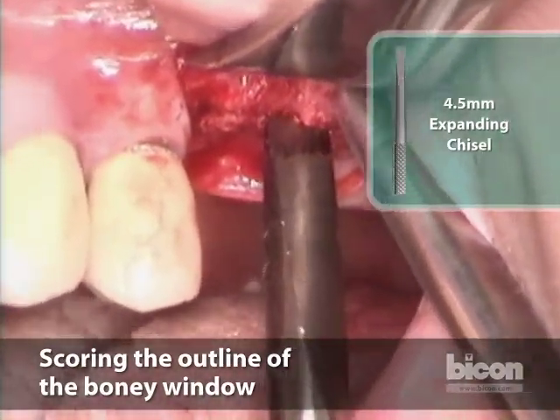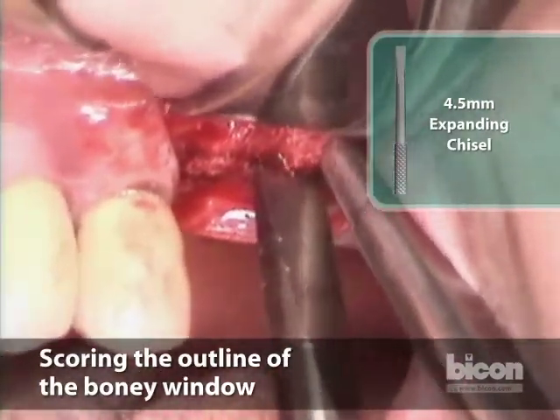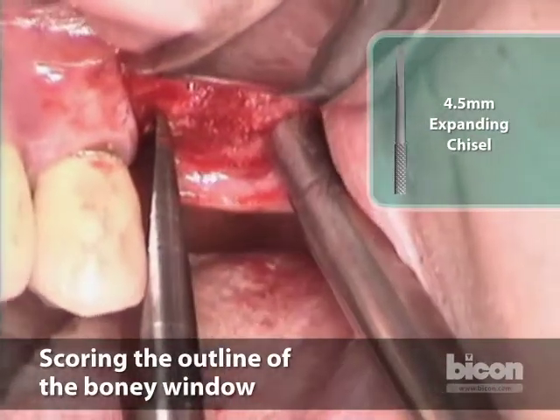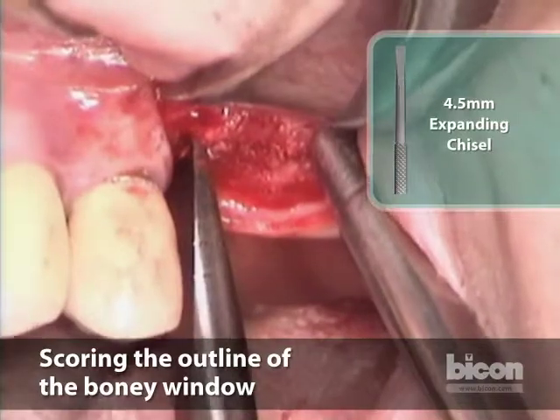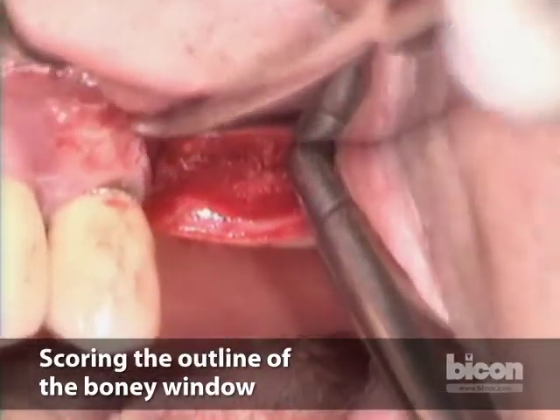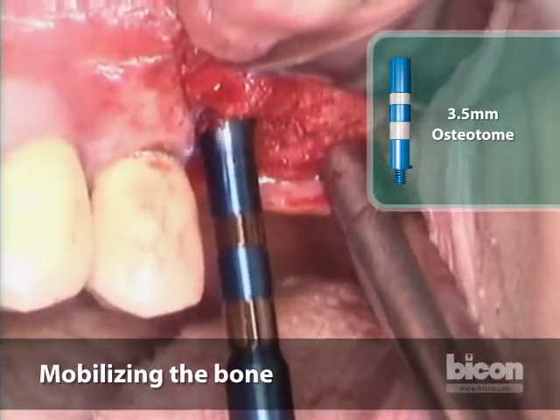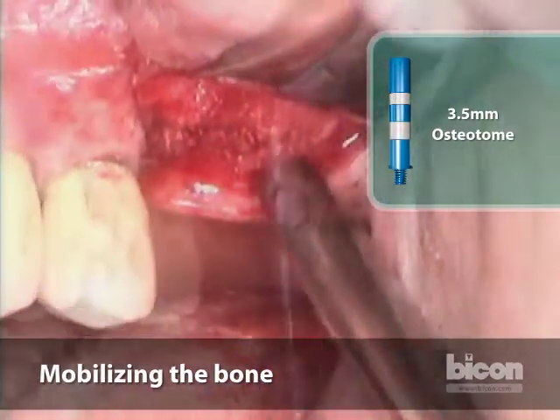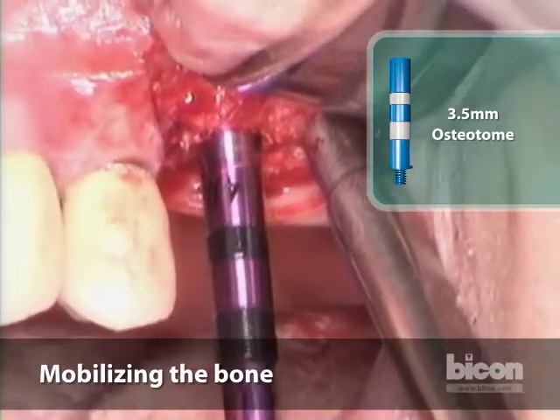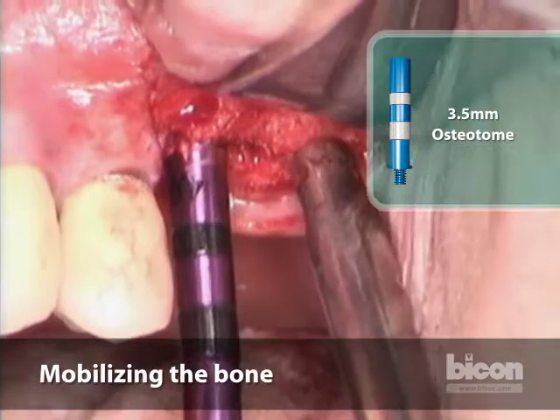There are some advantages to using piezosurgery; however, I found that using the osteotomes saves us from any loss of bone, except that it is very loud — especially if you are the patient. We'll mobilize it some more, and you can hear the sound is slightly different now. We're starting to see it mobilizing. There we go — it just mobilized on the distal, which is thinner.